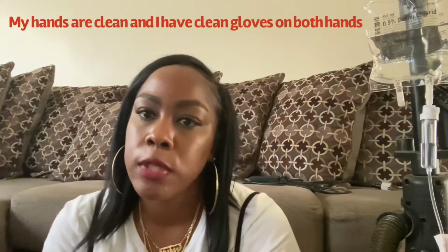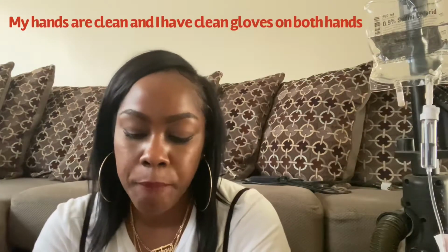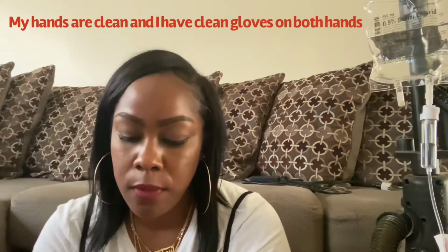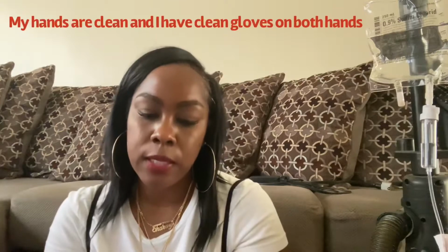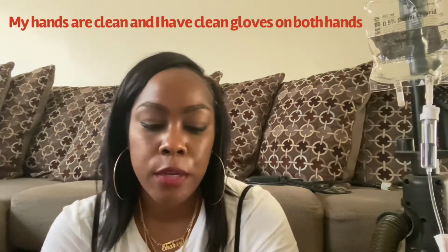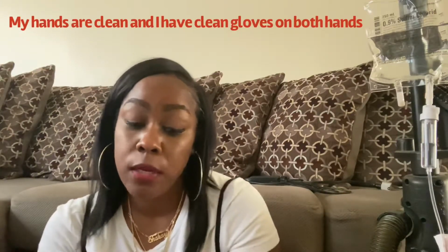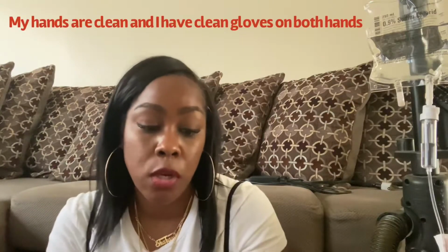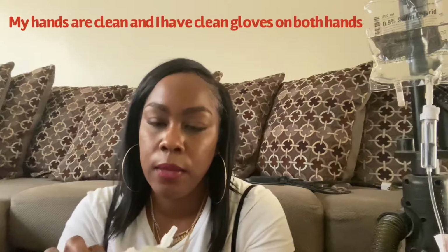Of course, we're going to do the exact same thing that we did with the normal saline. We're going to do the 6 rights that I said previously at the beginning, and then, of course, the 2 patient identifiers, as well as labeling. I can't stress that enough. I was taught to label everything. So anyway, we're going to do that.